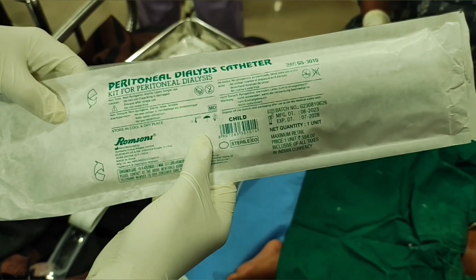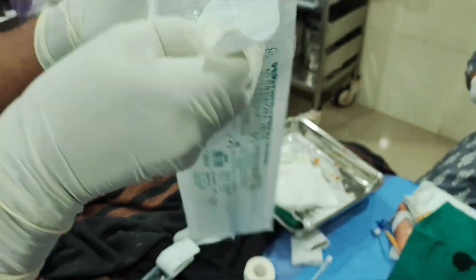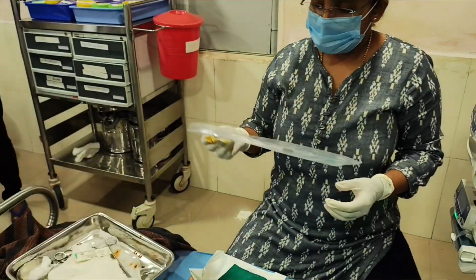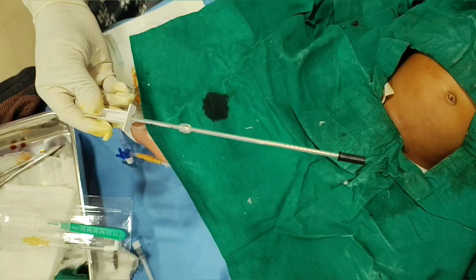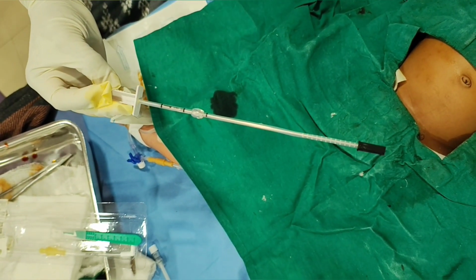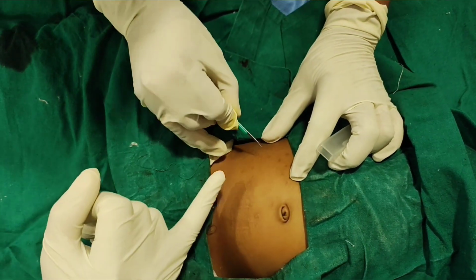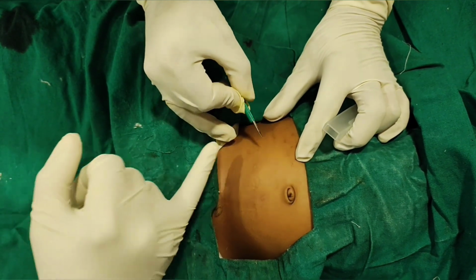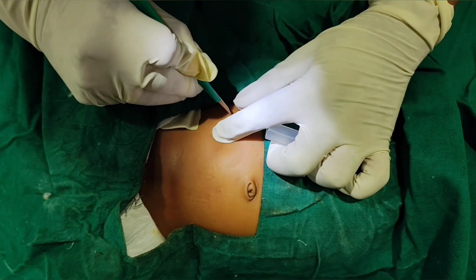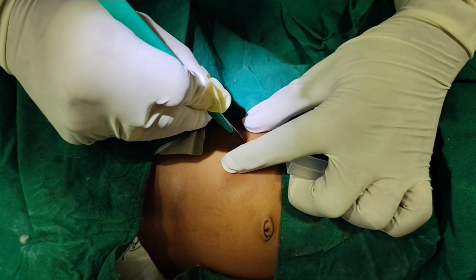Now we have to insert an appropriate size PD catheter. Is it trocar with PD catheter with a single bulb? Okay. Now for the insertion of the PD catheter, we need to take a skin incision, that is the paramedian approach, at the junction of the upper 1/3 and lower 2/3 of the right or left spino-umbilical line.